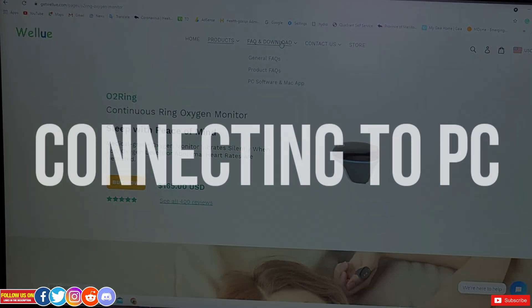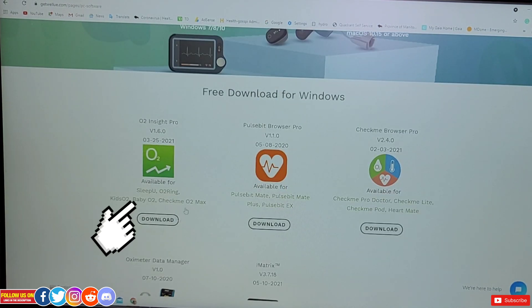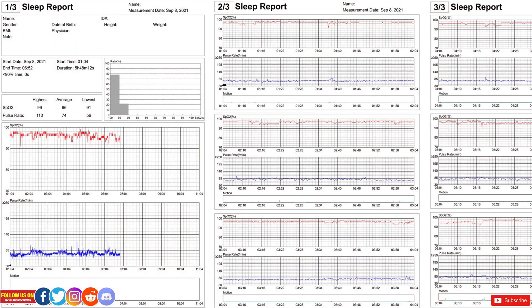You can also plug the device directly into a PC using the O2 Insight Pro software, currently version 1.6.0, available for free from their website and compatible with multiple devices including the Baby O2. When you open the software and click the download button, it downloads all four stored readings from the device. You can also export data to a variety of formats for a pediatrician to review. The PC graph is very easy to interpret.